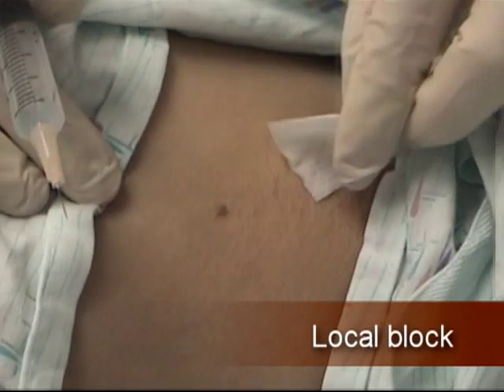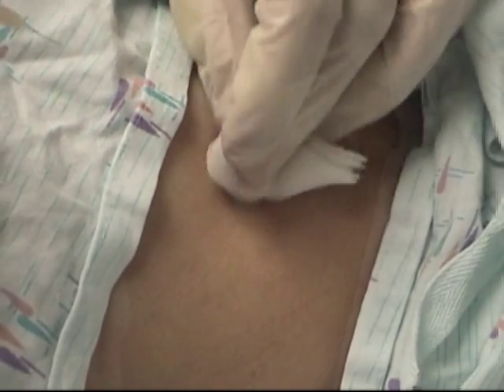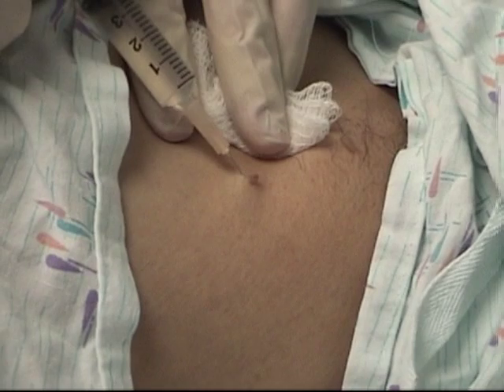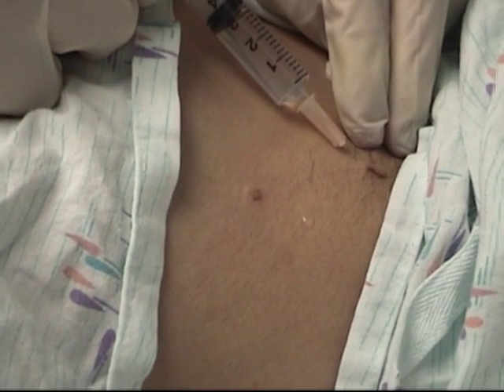Wipe the skin with antiseptic solution. Treat skin tags with or without anesthesia, depending on patient preference and the size of the tag to be removed. Make a small wheel of local anesthetic under each skin tag.